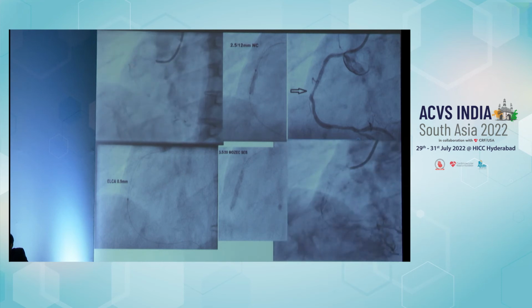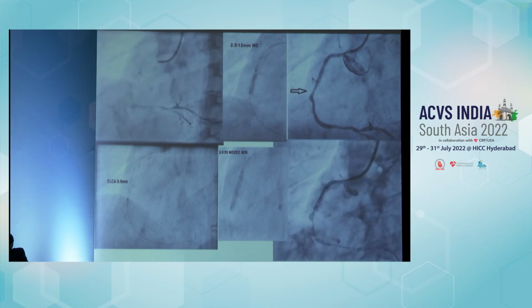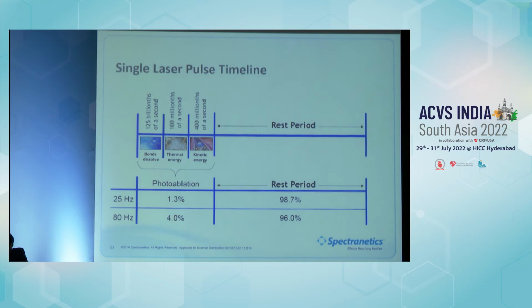And this patient has more than 1 year follow-up, he didn't have restenosis. We plan to do a check angio again to see the status. In the single laser pulse timeline, the photoablation part is very minimal, and the rest of the part is rest period. Only 1.3% of the time is photoablation time, 98.7% is rest period, so that in the meantime the overheating doesn't occur.